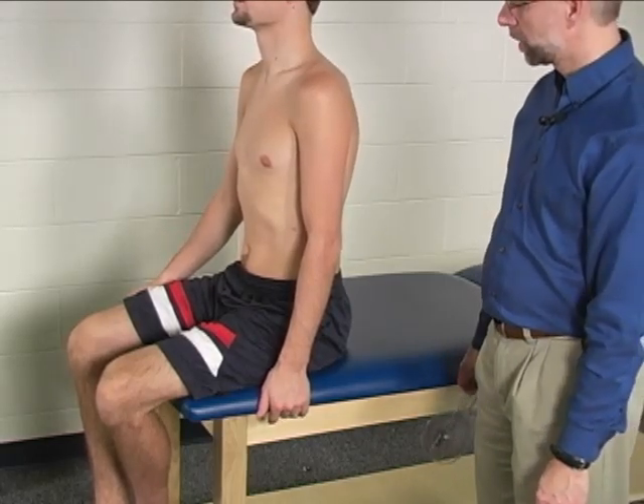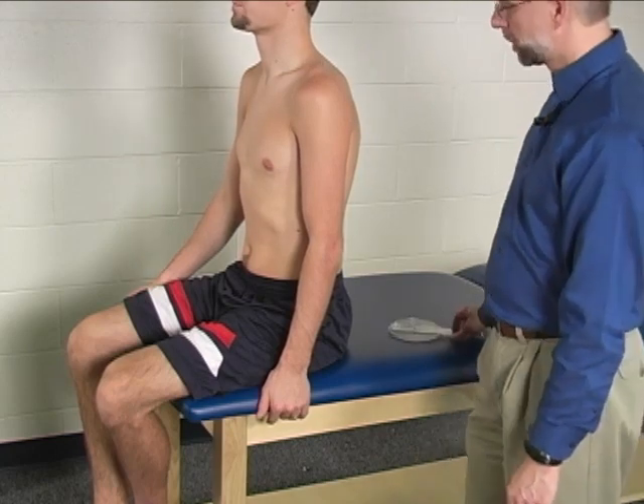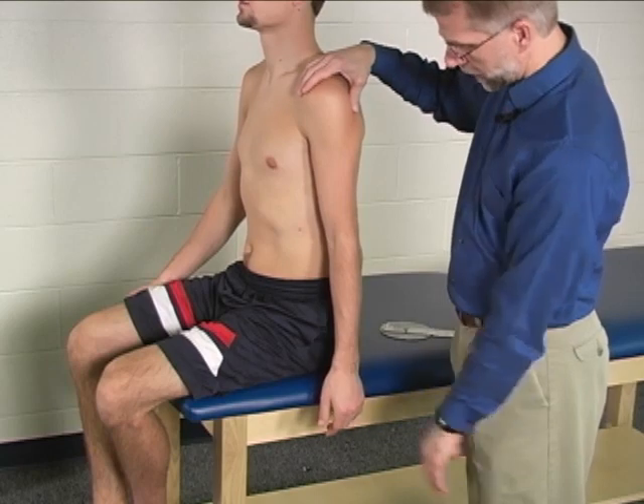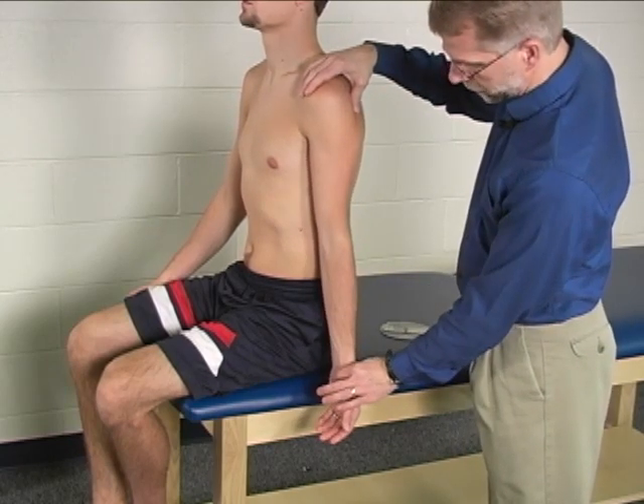In order to measure elbow active range of motion from extension to flexion, the patient can be seated or standing. The arm is simply held at the side with the forearm in full supination.